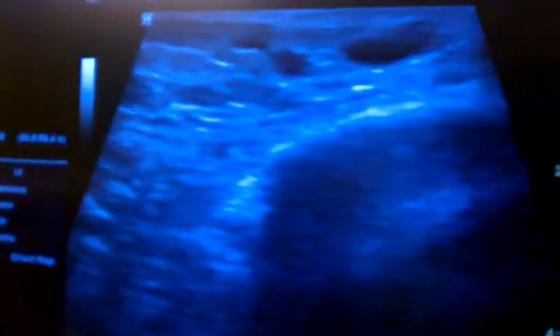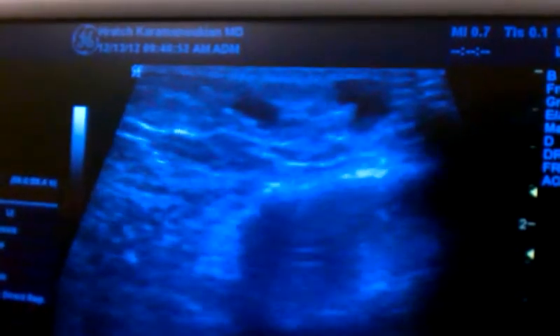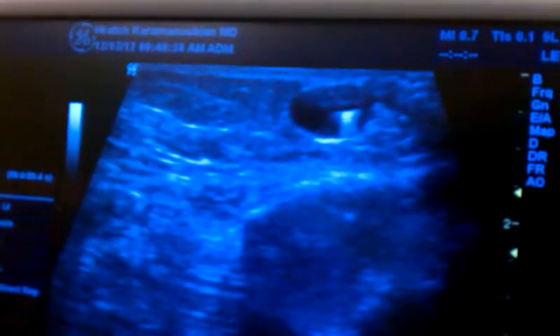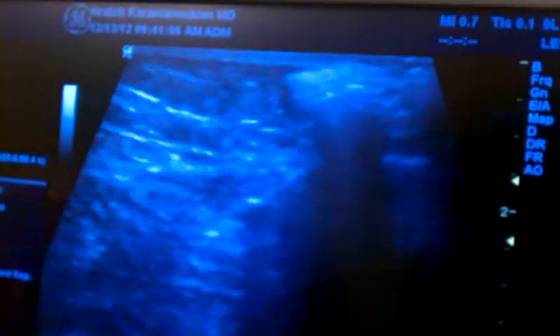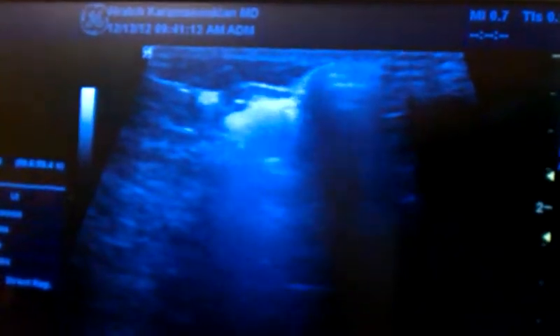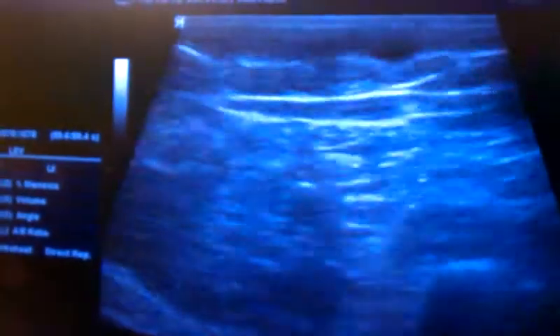You can see the varicose veins — there are many. You'll see the needle come in. That's a big vein. The tip of the needle is echogenic — that's why you see all that. And then you can see it as I move up. Sclerosing foam in the branches. I'm over the knee now, and then I'm moving up. You can see that these other branches are all somewhat injected.